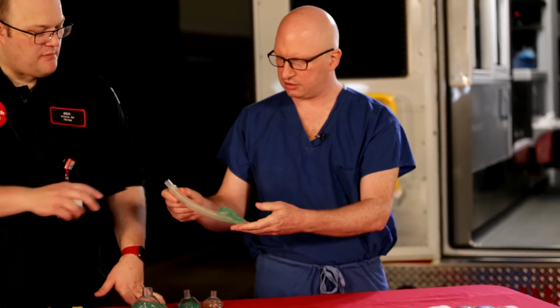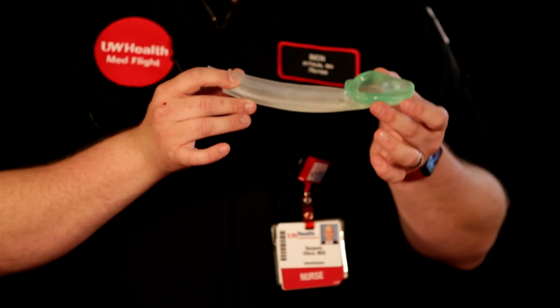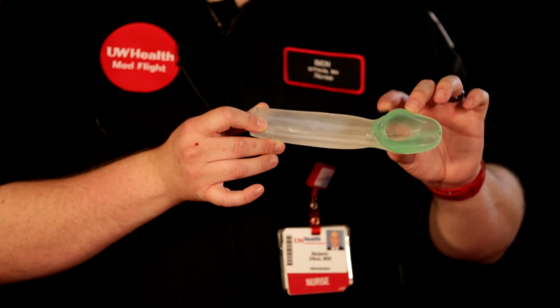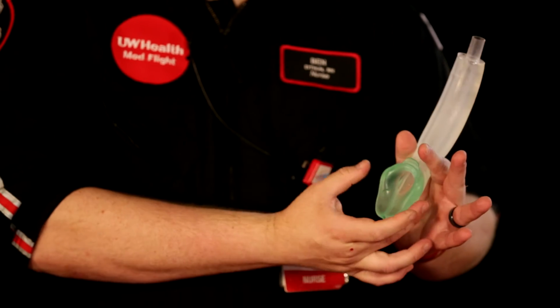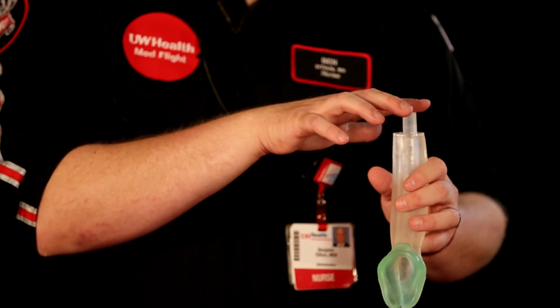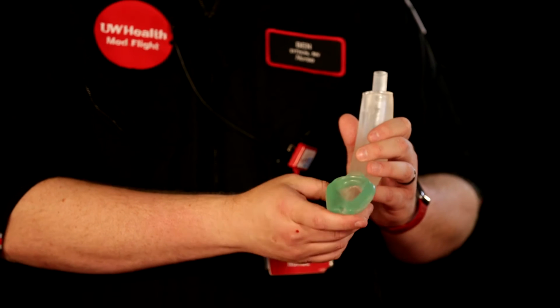This is the i-gel, right? Absolutely. So the i-gel is going to be more similar to the LMAs that we see in hospital settings, or some prehospital used to have more LMAs before the i-gels became popular. The traditional LMA will have the part that goes into the larynx, and this is usually either air-filled, or in the case of an i-gel, it's gel-filled. This will sit in the back of the airway. The gel will actually start to mold to the airway to make a better seal. And then you can attach your bag here and drive air, again, upwards towards the trachea.